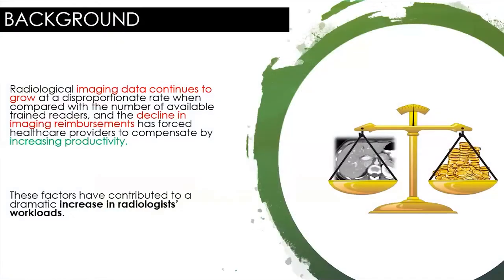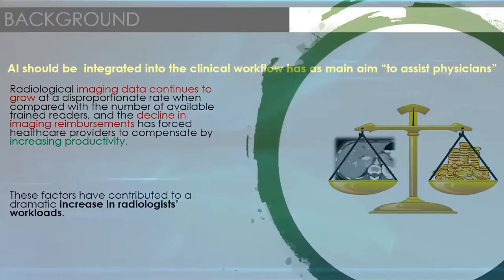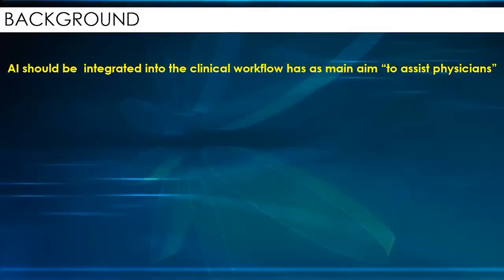But why is there such an important demand for artificial intelligence in today's clinical practice? I think the most important reason is the continuous increase in imaging data and in productivity in the radiological center. At the same time, we assist in a significant reduction of readers. So we need someone or something that works on behalf of us or supports us in everyday clinical practice. And for this reason, we should define the most important aim of artificial intelligence.